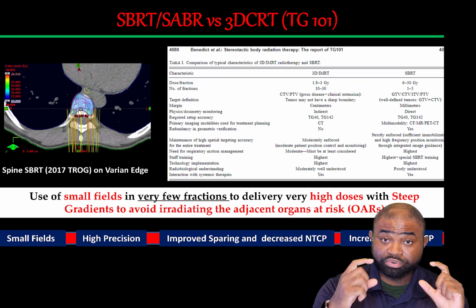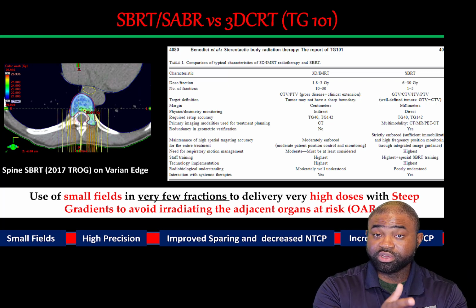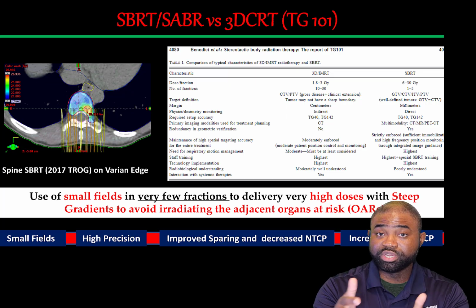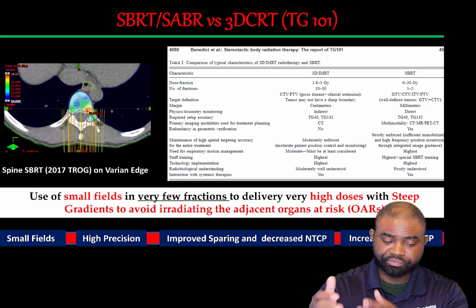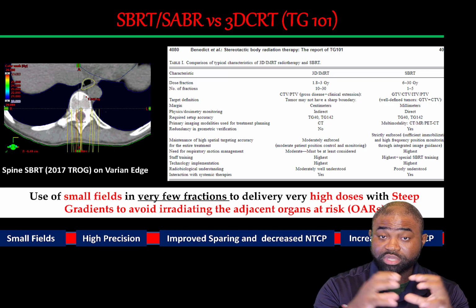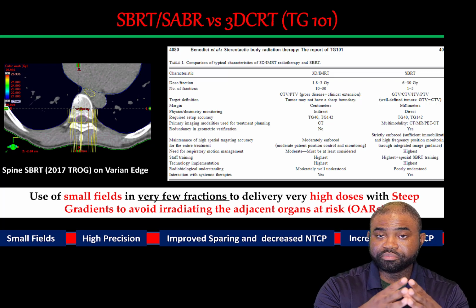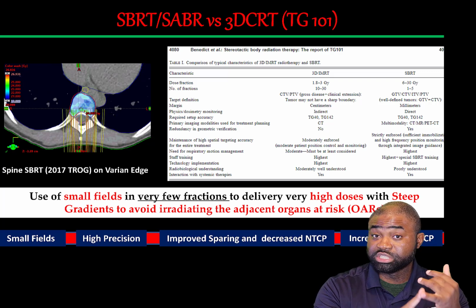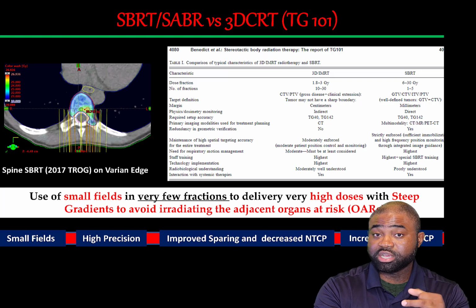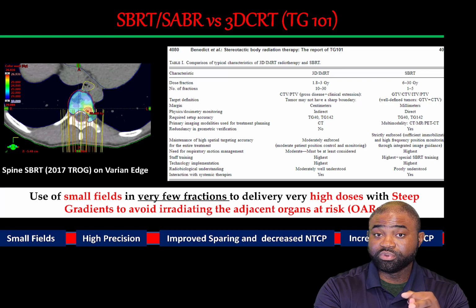This particular premise implies that how we go about conventional radiation therapy is remarkably different from how we go about stereotactic radiosurgery. Now, in terms of target definition, in both cases, we use ICRU 50 and 62, I think, to define our GTV, the gross tumor volume, to define our PTV, the planning target volume, and our CTV, the clinical target volume.